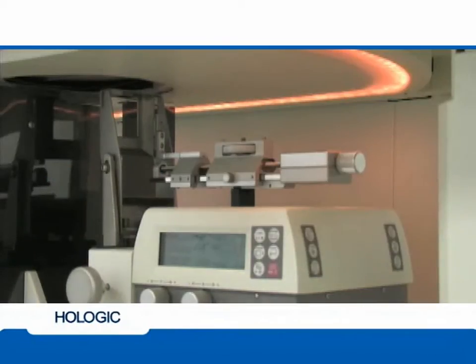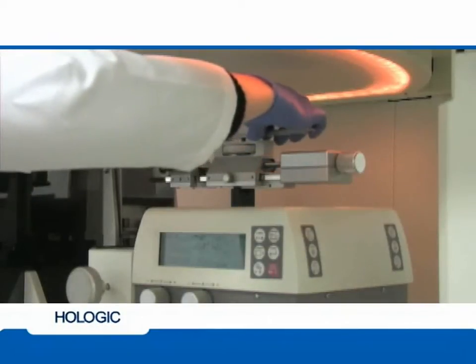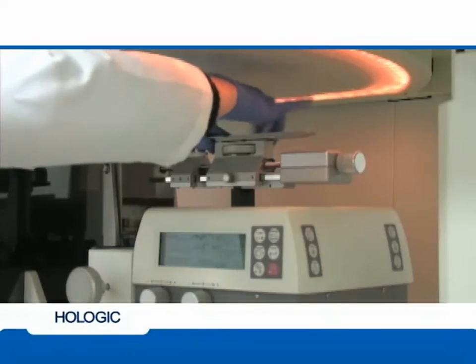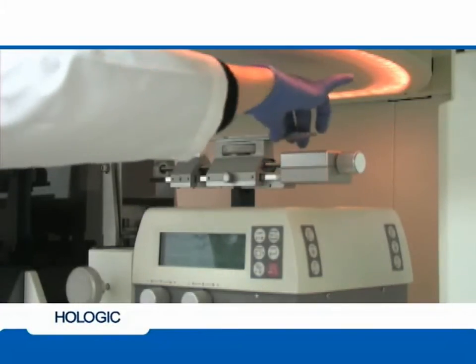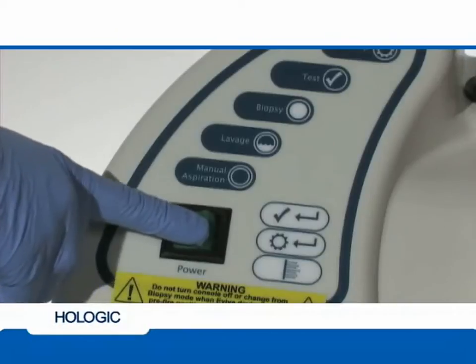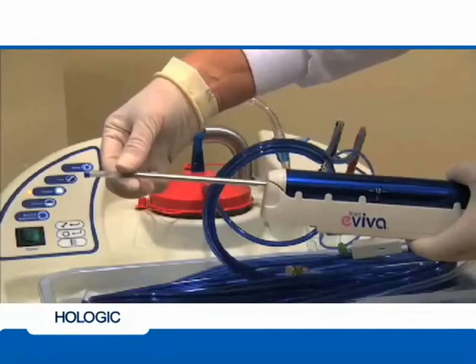With the Z dialed to the most negative position, the Eviva stereotactic adapter is secured to the top of the stage and tightened in place by turning the wheel. Check to make sure the adapter is secure, not tilted. Once the adapter is secure, raise the stage to biopsy-ready height. Turn the console on if you powered down after test and setup.